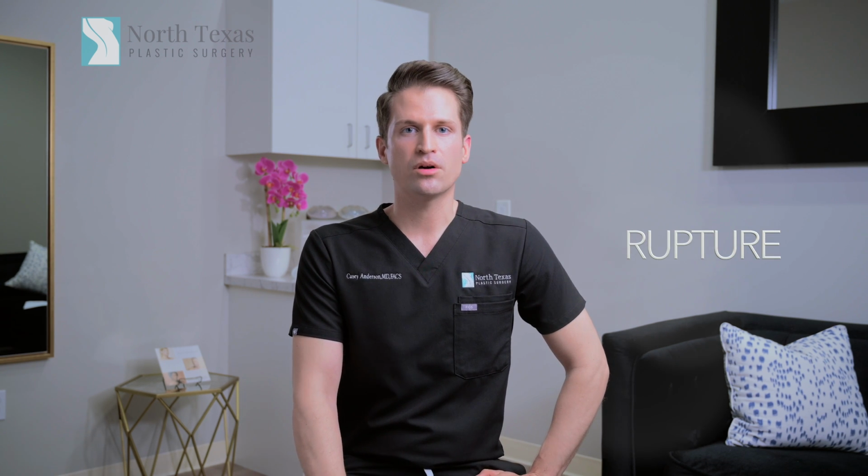Additionally, a patient may prefer a saline implant because it can be a little less expensive than a silicone implant is. And again, that's a preference thing. We'll go over the pros and cons of both. One of the biggest things people will ask about is rupture. And I don't care whether it's saline or silicone, that's always an important conversation to have so that you can be feeling like you have the most information for this product that's gonna go inside your body.